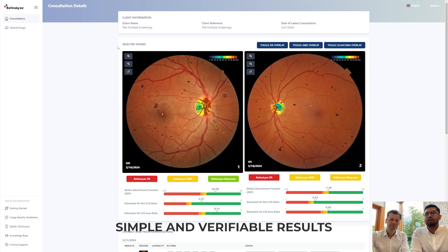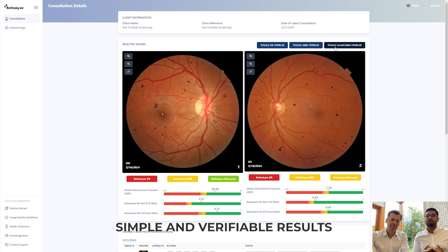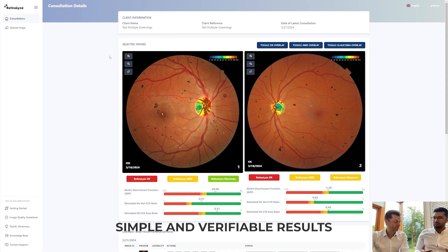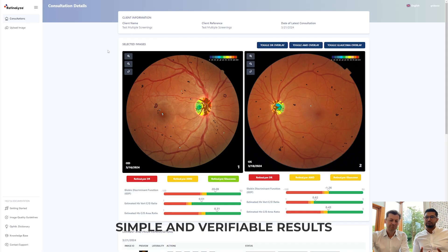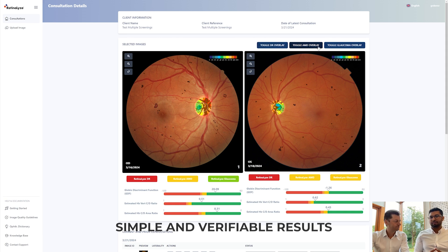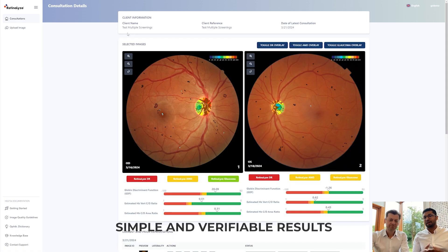If we open a consultation, you'll see the two latest retinal images displayed with overlays explaining what the AI identified as a pathology or biomarker for eye disease, plus an aggregated result at the bottom showing red, yellow, or green. Red means this is a case to refer to an eye specialist for diagnosis and treatment. Yellow means there's something to be alert about — ask more questions, take a deeper anamnesis, maybe perform extra tests. Green means the patient can return at the regular screening interval.